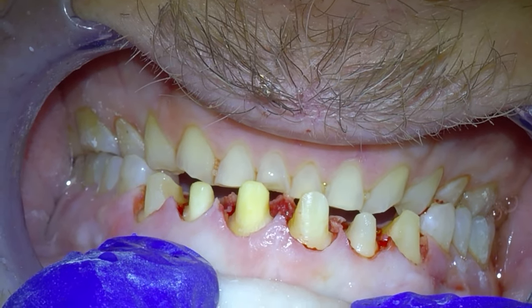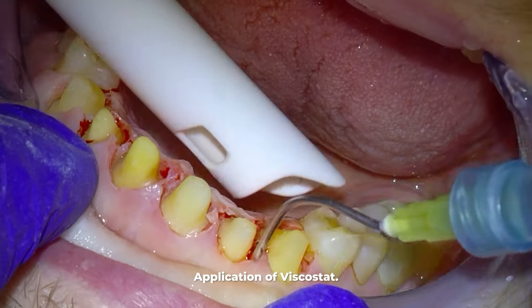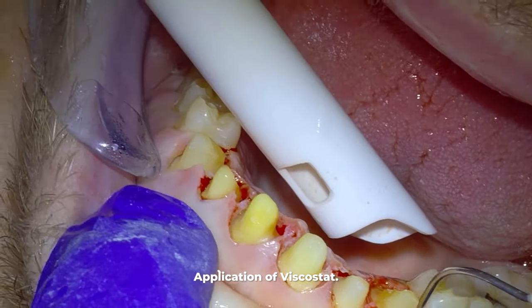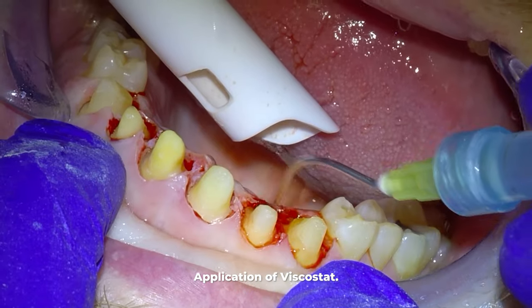I know it looks really odd, but this is the base from which we will build everything back up. If you think you couldn't do this, just remember there are tons of Hollywood stars out there who have crowns and veneers, and this is what their teeth look like underneath.